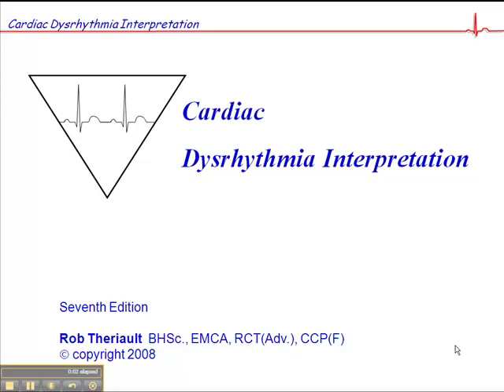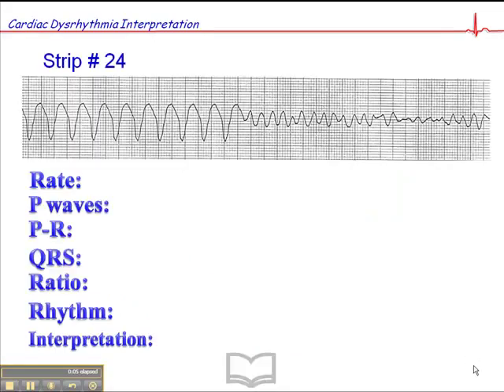This is ECG exercise number 24 on page 96. This is a bit of a chaotic rhythm. Here we have a heart rate of approximately 210 initially, about 210 beats per minute. And then it suddenly deteriorates into this chaotic rhythm down here.